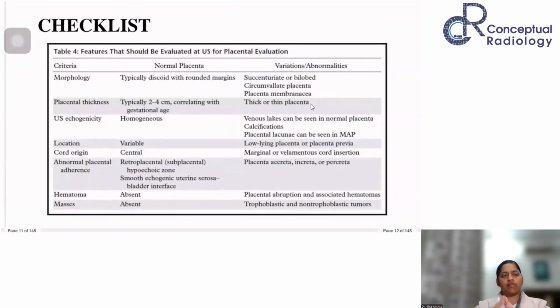Right. So this was embryology. If you have any doubt, you can let me know at this point of time. Now we'll start with the radiology. So the checklist for doing an ultrasound for placenta. You are doing ultrasound for the entire baby, but placenta is something which is just limited to being the location. You just specify the placental location and whether it is above the os or not, and that's it. The placental evaluation stops there. But the evaluation of placenta is a lot more.